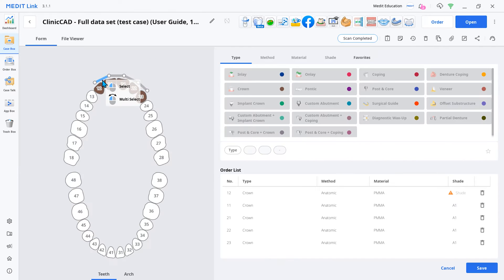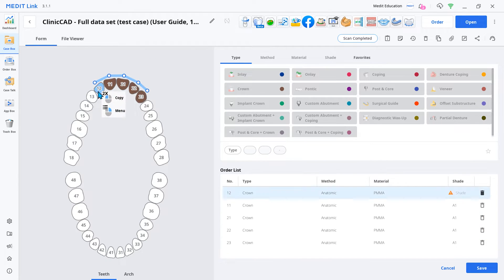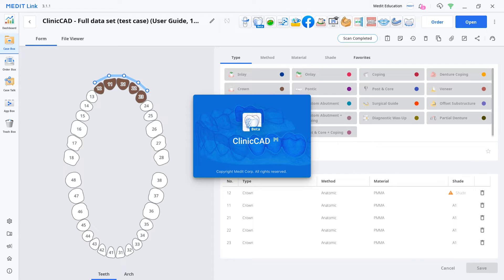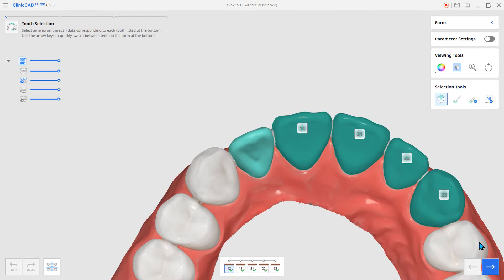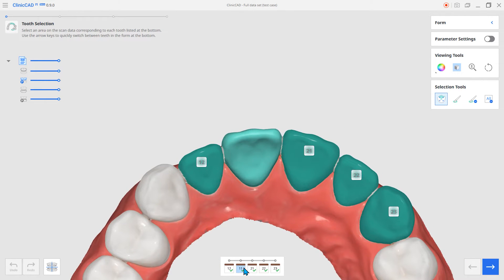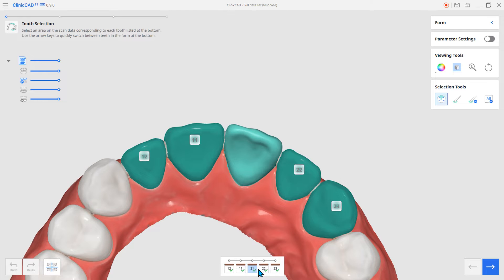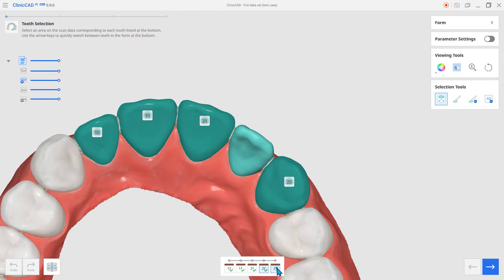The next feature is the Automatic Teeth Selection function during designing an eggshell crown. The AI recognizes the tooth number and automatically designates the tooth area.